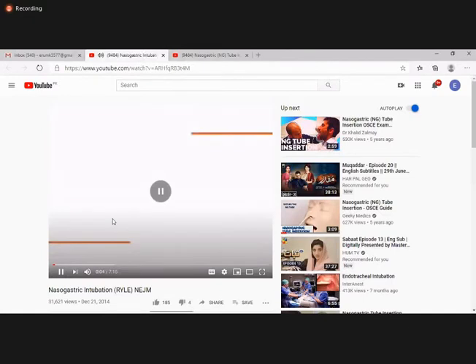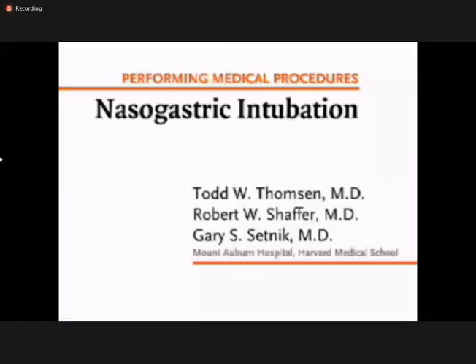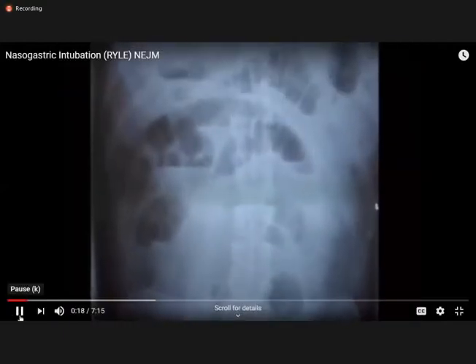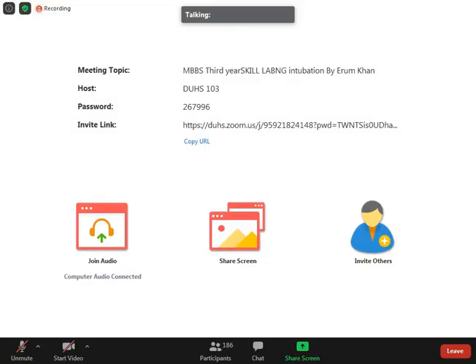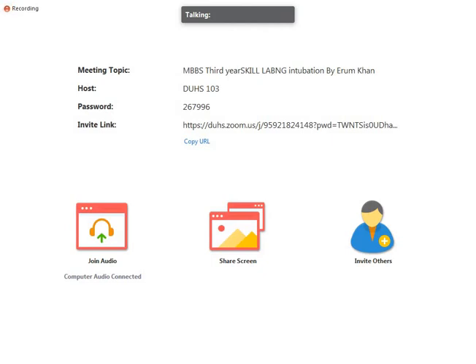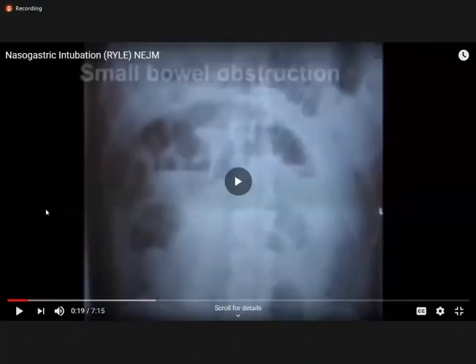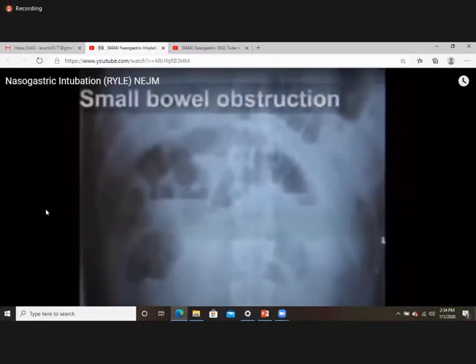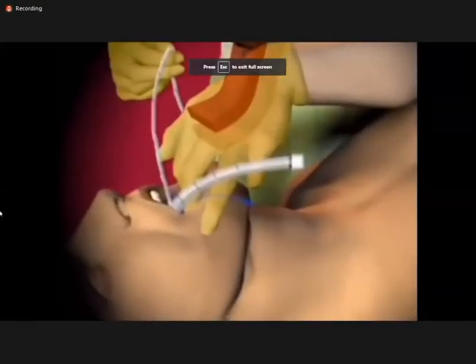This is a video in clinical medicine from the New England Journal of Medicine. Common indications for nasogastric intubation include decompression of the GI tract in patients with bowel obstruction and gastric emptying in intubated patients to prevent aspiration.